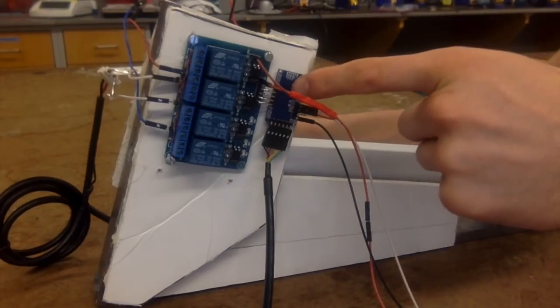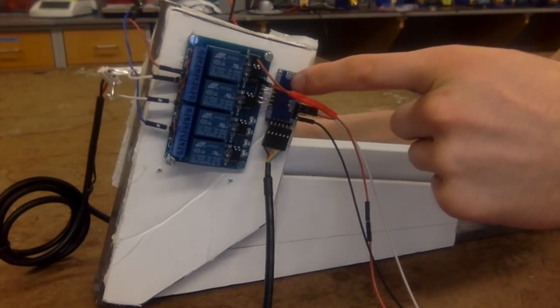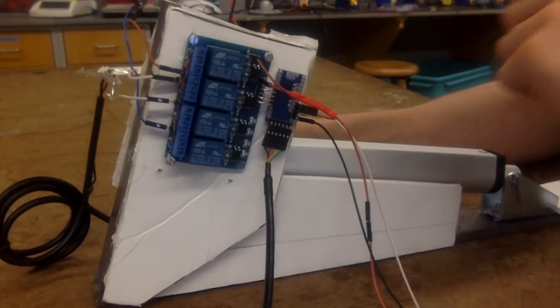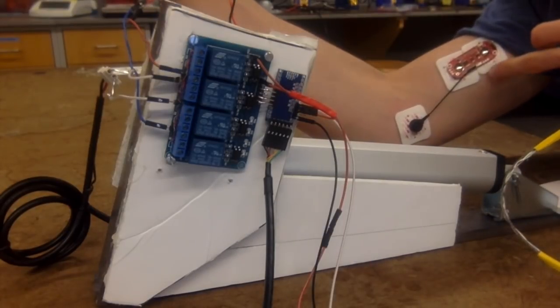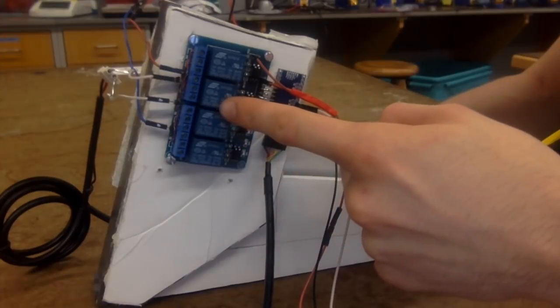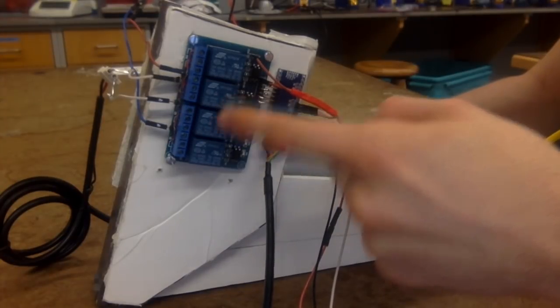Before we get into the build, let's go over how it works. This is an Arduino, which takes electrical signals from the myoelectric sensor, which is attached to the bicep. And by using this relay board, tells the arm whether it should bend or extend.